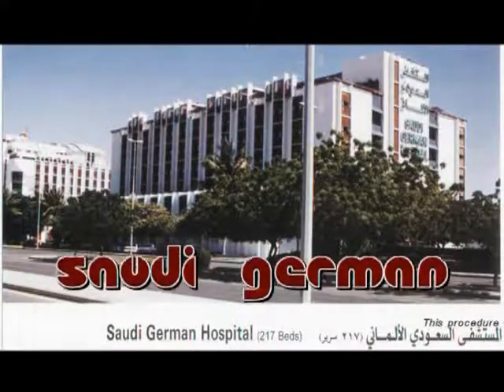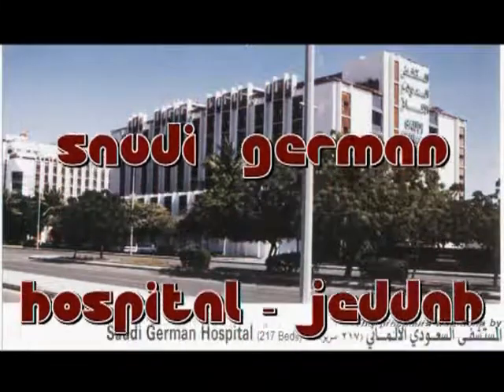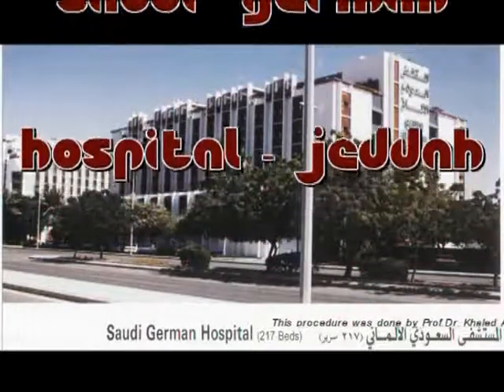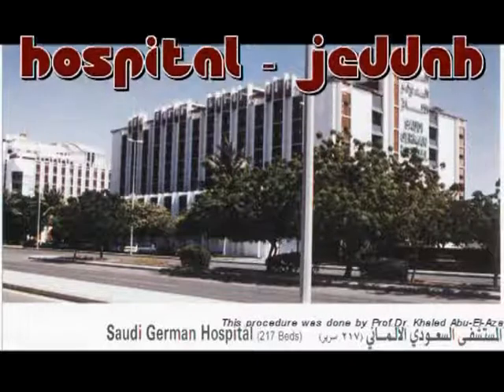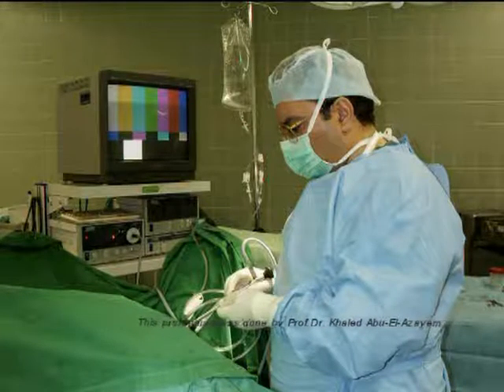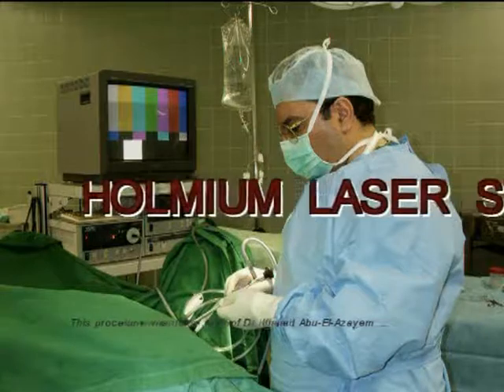Dear colleagues, this video shows the use of Holmium laser for stone fragmentation. This is our Saudi German Hospital in Jeddah, and this is our OR theater where we are doing our operations.